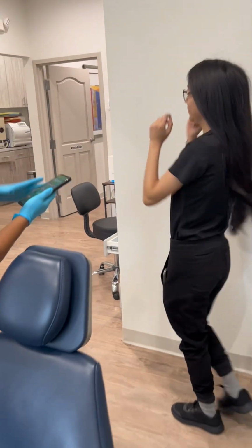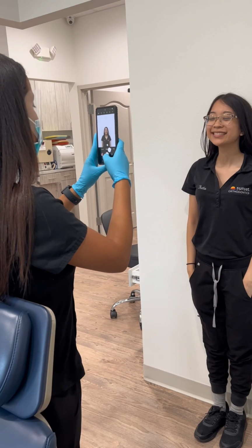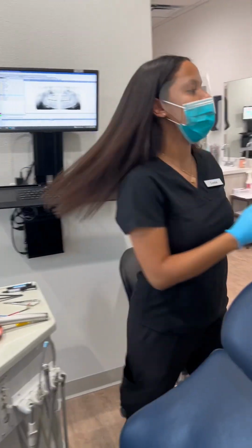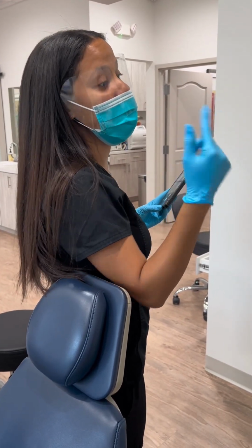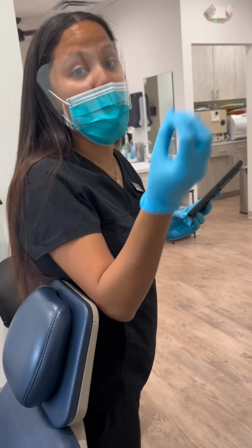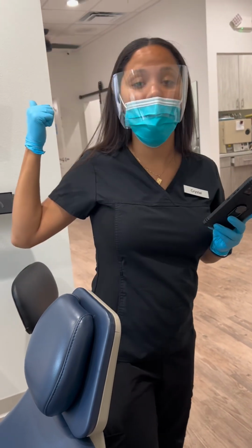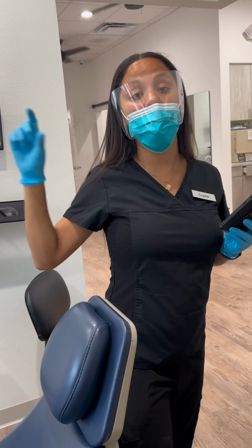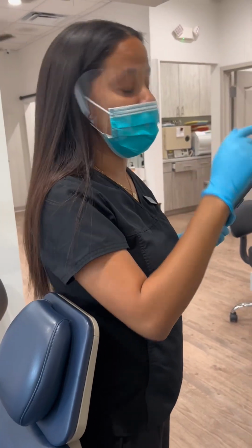All right, so the first picture is going to be a frontal picture. I would take a picture of the name first, okay? Then start these pictures, because when you start downloading them into the system, we need to know who the patient is. So make sure you take a picture of the name on the router, or you could even take a picture without flash of the chart, the patient's name on the chart. That way we know. So that's going to be your first picture. Then after that, you're going to start your pictures, okay?